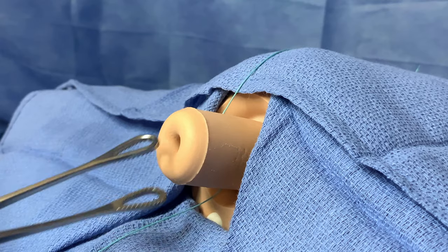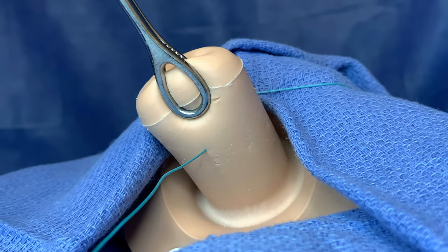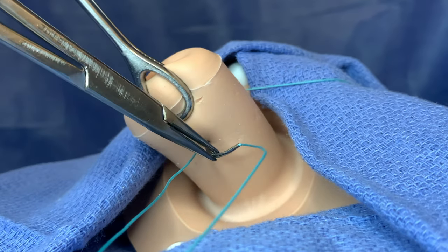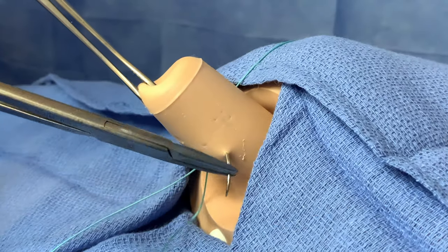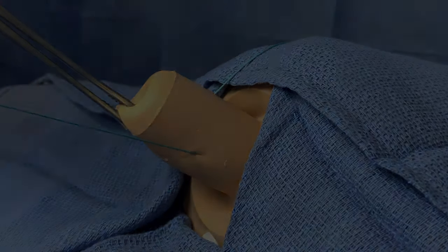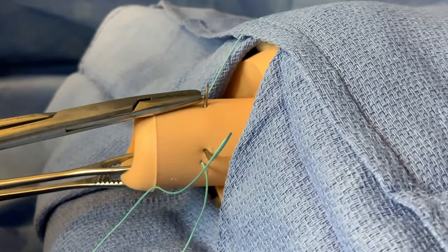The ring forcep can be repositioned to the posterior lip of the cervix for better traction for the next insertion site. Continue to travel around the posterior cervix, entering this time at 5 o'clock using the same maneuver. Be mindful of the needle's exit as the cervical vessels are at 3 o'clock. Some surgeons prefer to backhand this suture. The last insertion site is at 2 o'clock, exiting near the initial insertion point.